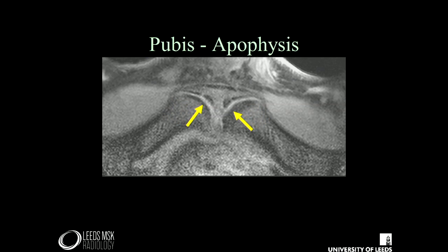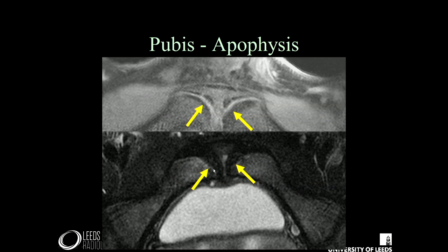The pubis itself has an apophysis, which lies on the anteromedial aspect of the pubis. Here we have the body of the pubis, a chondral area, and ossification in the growth plate with the capsule lying more anteriorly. This apophysis is also the area where we get stress reaction in the adult population. Like the iliac crest, it is a very late fusion — still present in athletes up to the age of 23 years when all other apophyses have fused. When it fuses, you can get an area of sclerosis in the bone marrow, more sclerotic and less bone marrow fat, but this is normal.